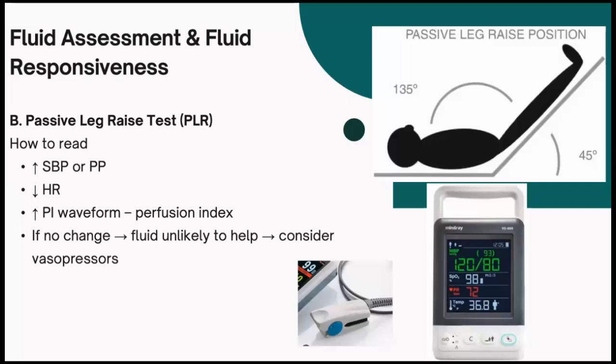So next time, ask the patient to take a deep breath, especially one who is fasted coming into the theater. Just have a look at the pulse oximeter quietly and see whether you see a massive swing. That is also an indicator that the patient is under-volume. So these are very simple things you can use. The pulse oximeter is everywhere, so that is another monitor you can use to guide your fluids.